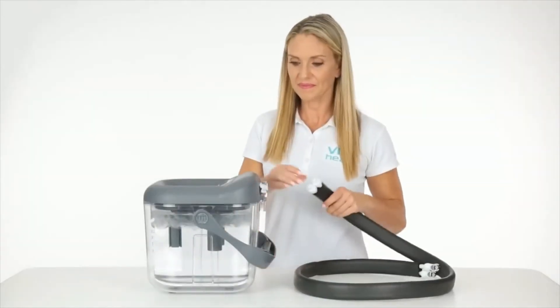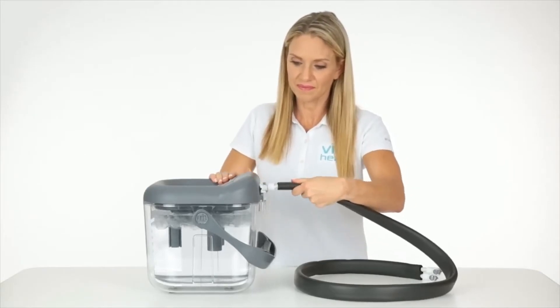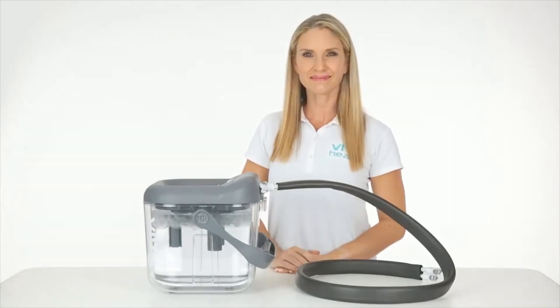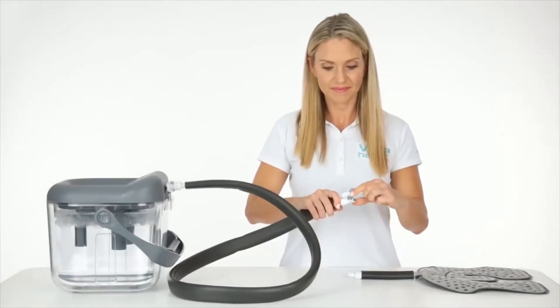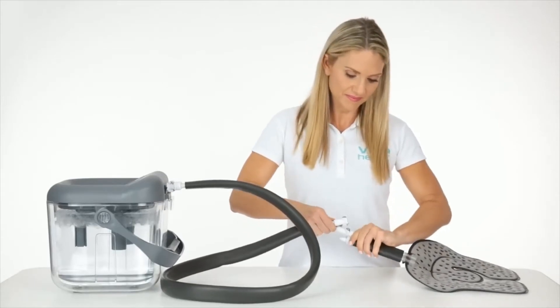To connect the hose, push down on the metal lock above each valve and push the hose nozzle in until you hear it click. To connect the cold therapy pad, push down on the metal lock above each hose valve and push the nozzles in until you hear a click.